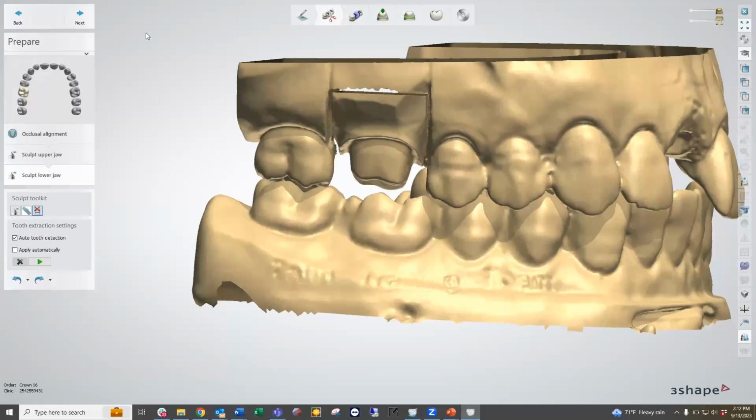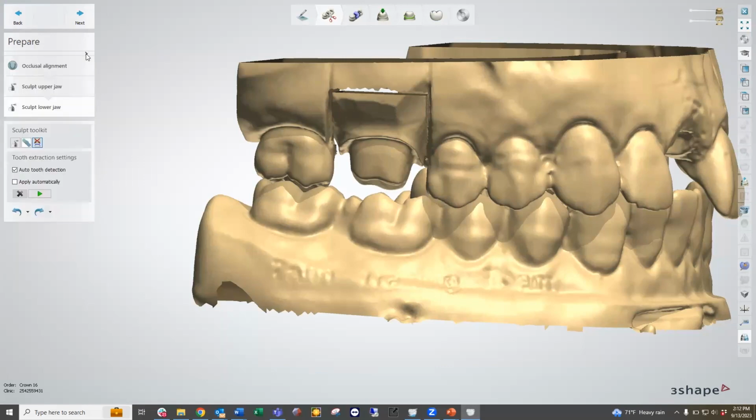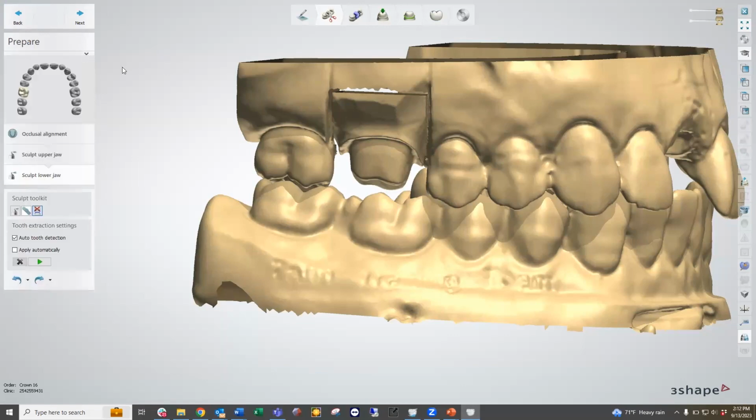So after the navigation panel, we have our step stage. An individual step is going to be listed out here, and then underneath that are going to be your sub steps. So each step is going to have its major portion here and then the minor portions underneath it. If you click on this, it allows you to minimize or hide those individual areas. And then each sub-step will have a list of directions, or a manual of arms, that we're going to be using to go through that sub-step and complete all the necessary required tasks within it. I should have probably said that prior to this, but at least we have that knowledge going forward.